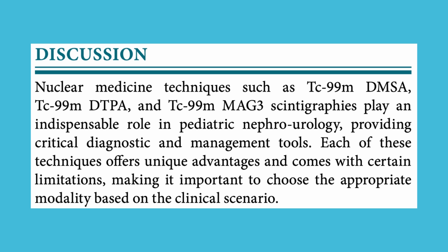Discussion. Nuclear medicine techniques such as Tc-99m DMSA, Tc-99m DTPA, and Tc-99m MAG3 scintigraphies play an indispensable role in pediatric nephrourology, providing critical diagnostic and management tools. Each of these techniques offers unique advantages and comes with certain limitations, making it important to choose the appropriate modality based on the clinical scenario.